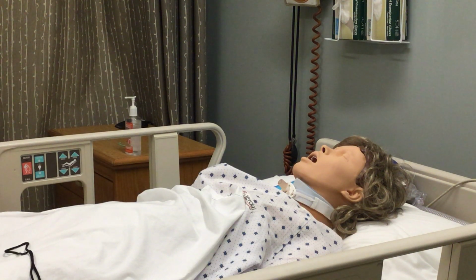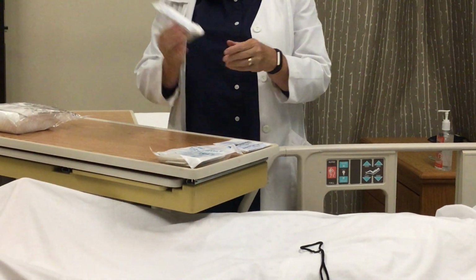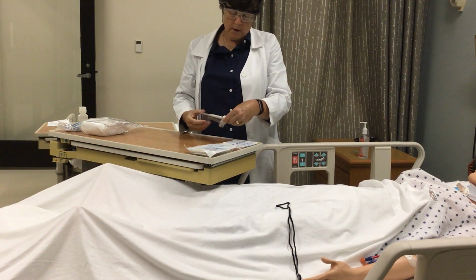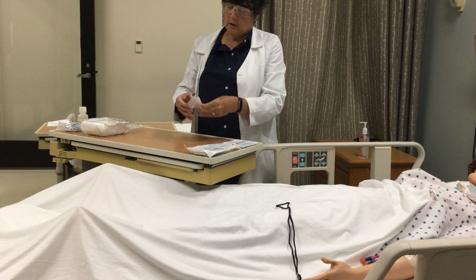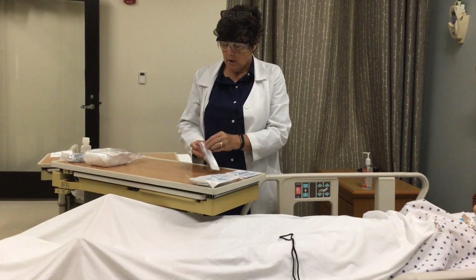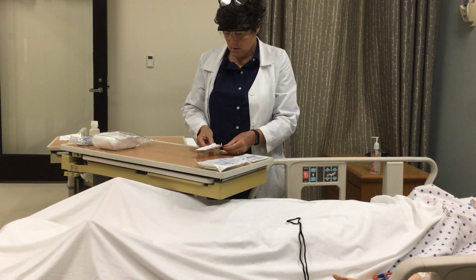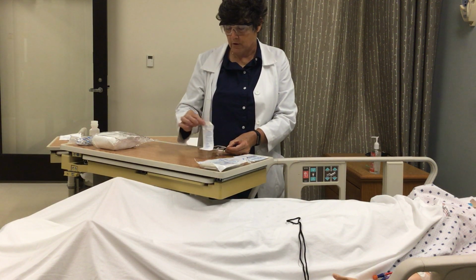If the patient had a disposable inner cannula, open this package next. Okay, for this I have the new inner cannula, which is disposable, and it's recognized by the acronym DIC with the size of the tracheostomy tube, which this one for our mannequins happens to be a number 4. Just like with all things, you open away from you first.